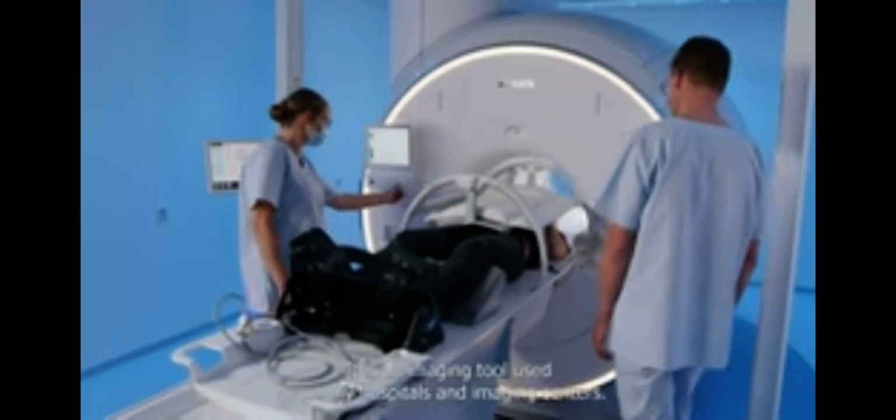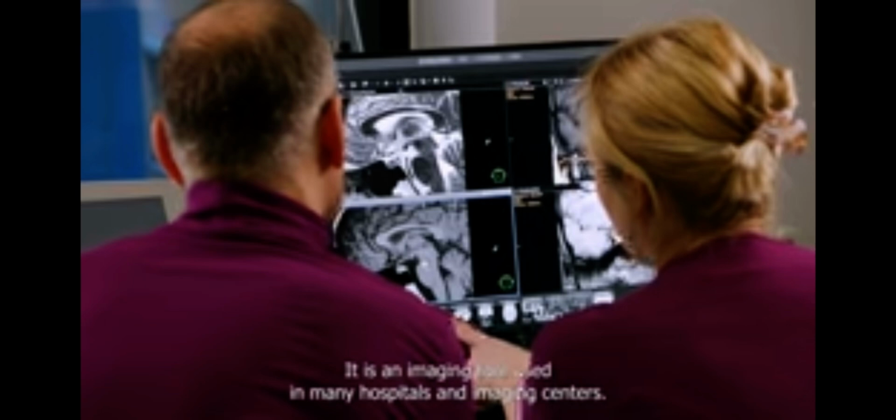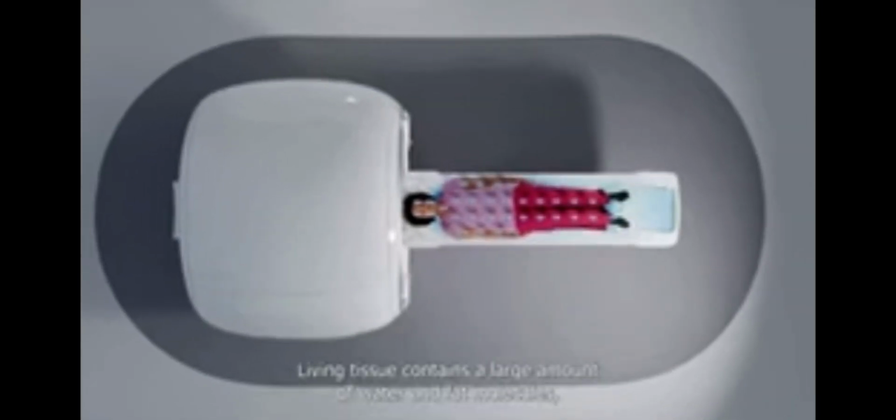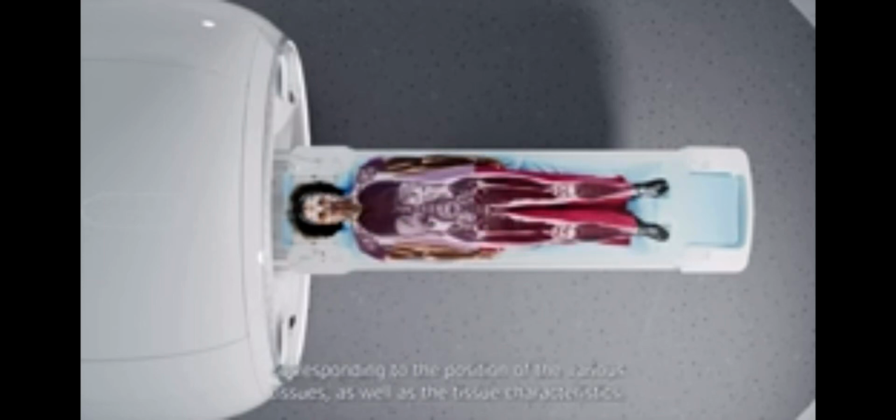Treatment planning capabilities. It is an imaging tool used in many hospitals and imaging centers. Living tissue contains a large amount of water and fat molecules, which contain hydrogen atoms. Magnetic resonance imaging uses the nuclei of these hydrogen atoms, also known as protons, to produce images. MRI can be used to show the position and concentration of the protons in the body corresponding to the position of the various tissues as well as the tissue characteristics.